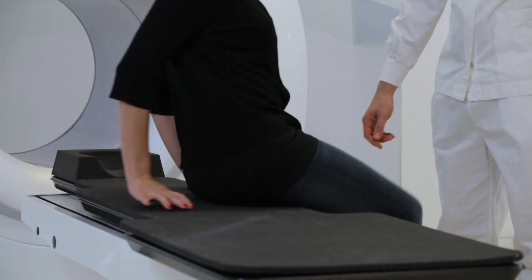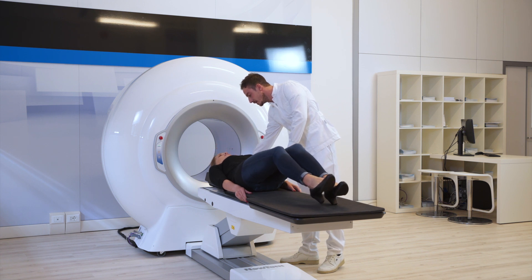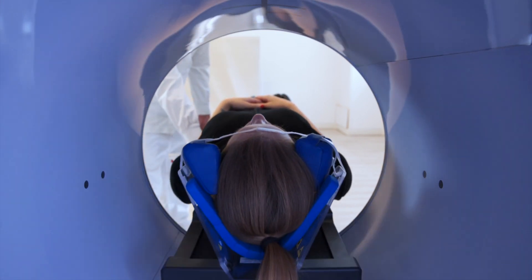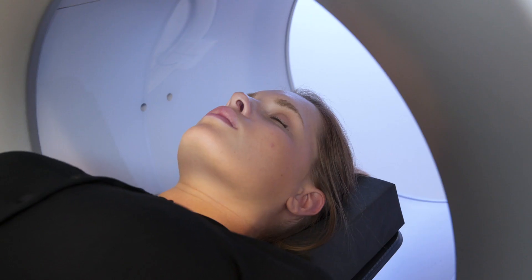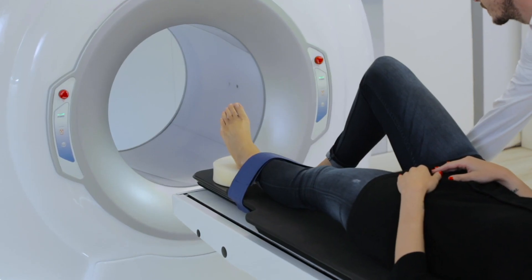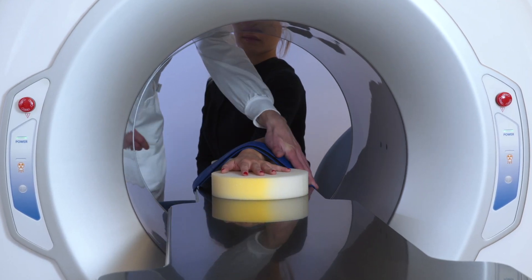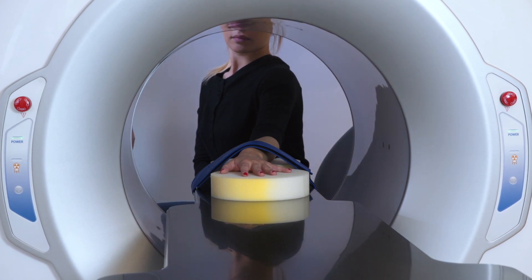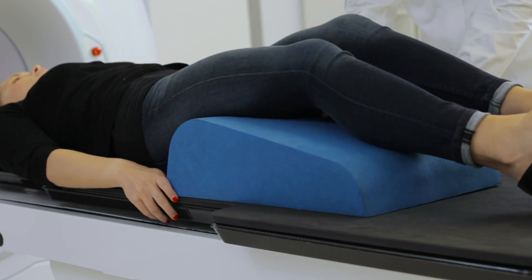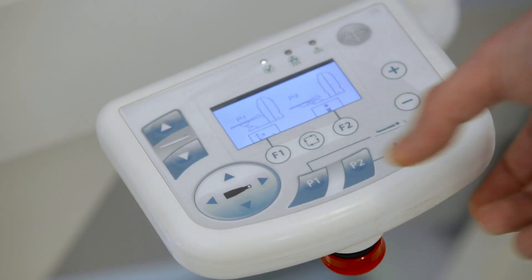Now the patient can sit down. We are going to describe the procedure to examine the anatomical region of the skull and neck. But with NewTom 5G XL, scans can also be performed of the lower limbs and upper limbs, with the patient lying down on the table or even sitting using a chair, with access to the gantry from the back of the machine. Once the anatomical region has been selected, the patient must be brought to the scan preparatory position by pressing the P1 key.